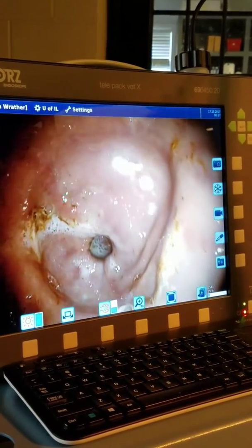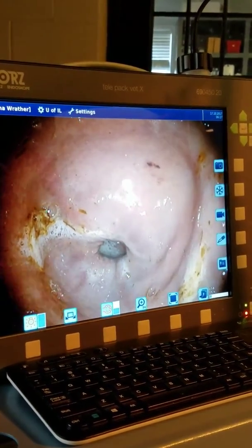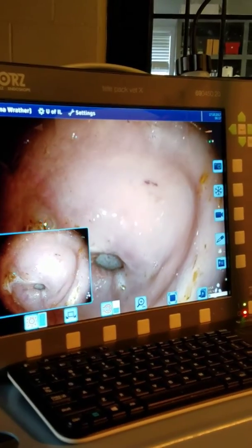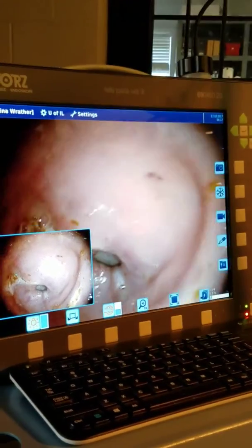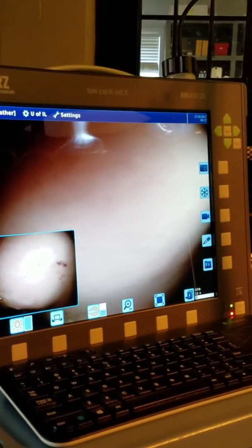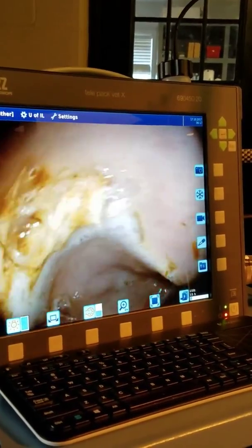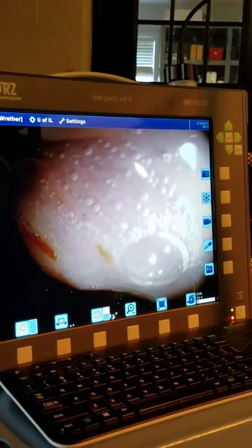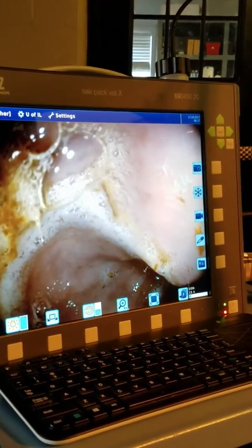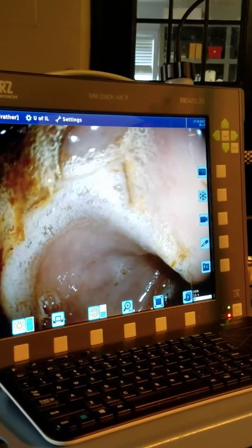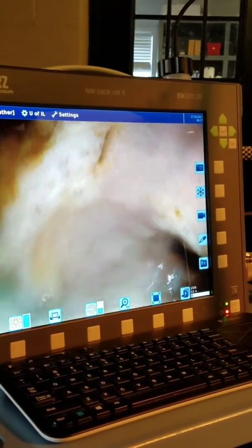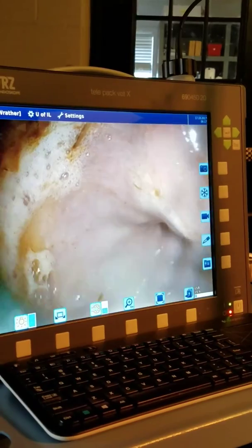So this is looking down, kind of at the bottom of his stomach where it goes into the small intestine. That's an ulcer right there. And sometimes these ulcers down here can be even more painful than the non-glandular ulcers, so that could be significant.